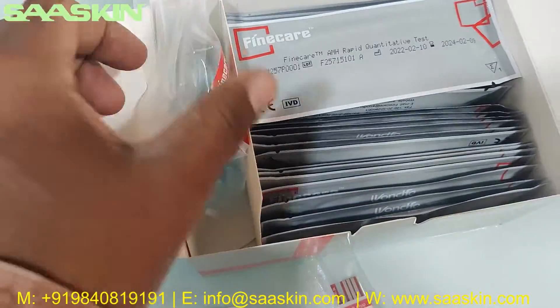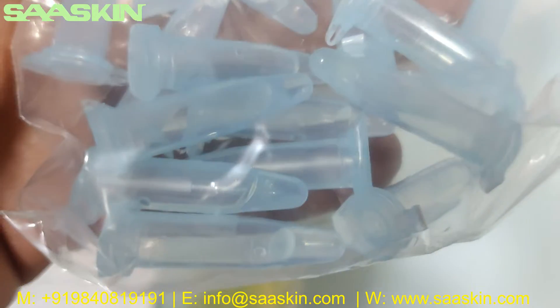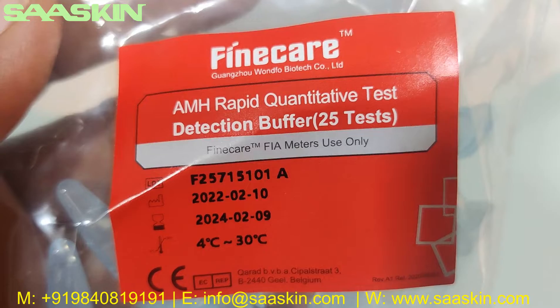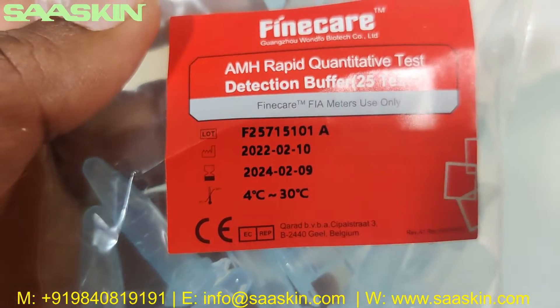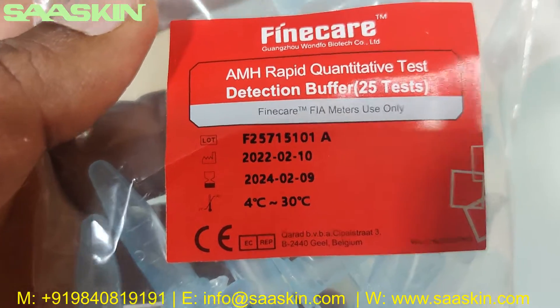You can also see the 25 detection buffers — that's the blue color detection buffers you can see here. It says 'AMH Rapid Quantitative Test Detection Buffers, 25 Test,' with the reference number, expiry period, and temperature range.